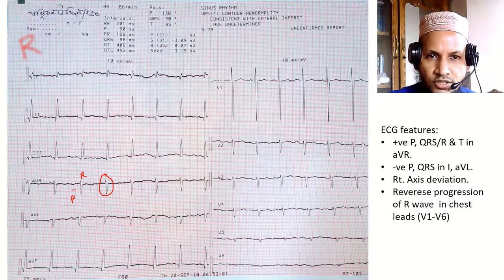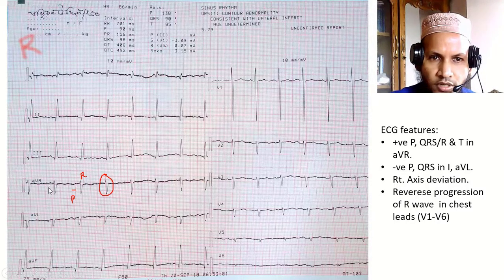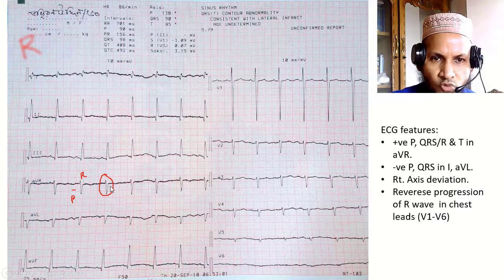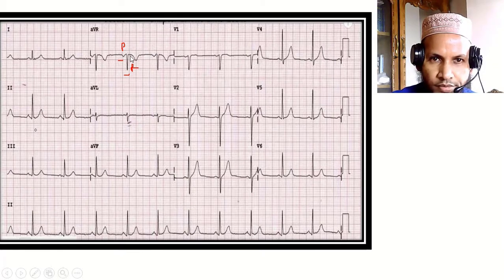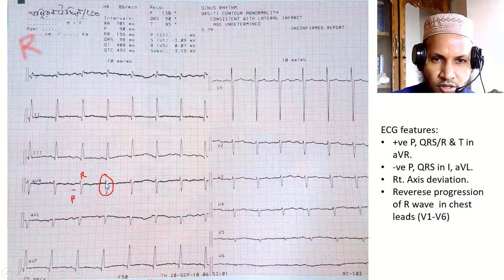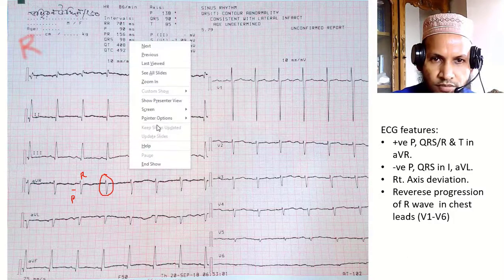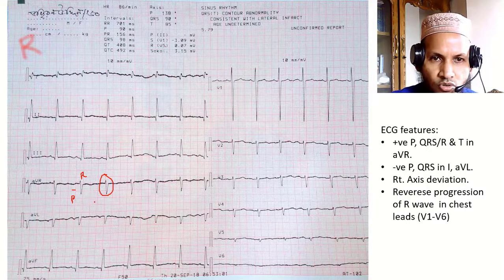In the ECG we can see some abnormality. In lead AVR there is a positive P wave and positive R wave or QRS complex. In a normal ECG the P wave remains negative and the R wave is also negative — there is no positive R wave in AVR. These abnormalities may be due to either dextrocardia or technical error, that is limb lead reversal.